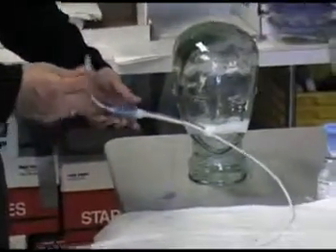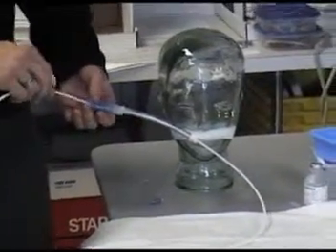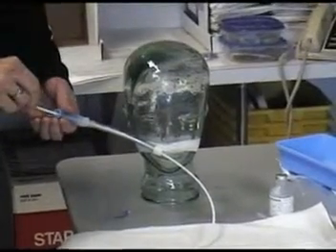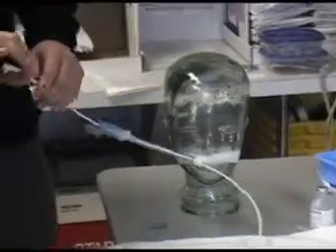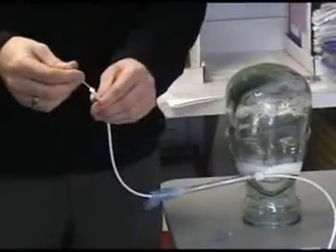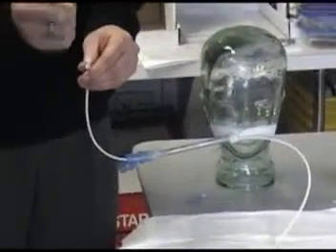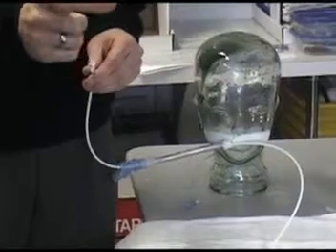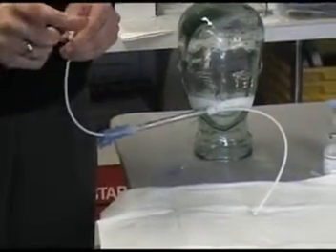Then what you'll do is you're down in the lower lung. You're semi-wedged down there, and what you need to do is remove the catheter 2 to 3 centimeters back. You're retracting it out of the lower lung for 2 to 3 centimeters. The reason is you're going to see this inner lumen of the catheter expel that plug, and it's also going to advance past the outer lumen 2 to 3 centimeters. Since you're already wedged up against the lower lung, you need to give that inner lumen of the catheter room to come out.